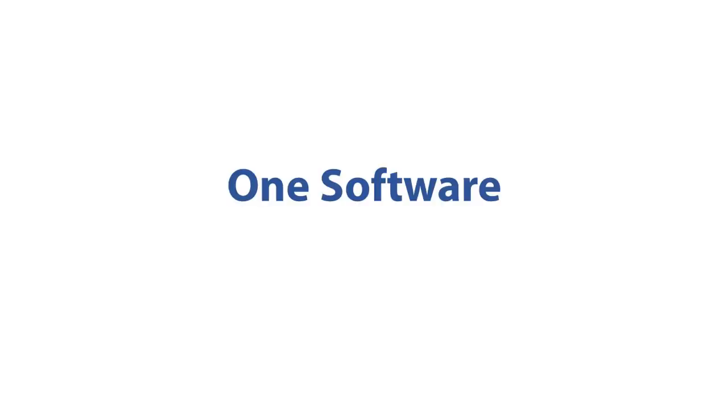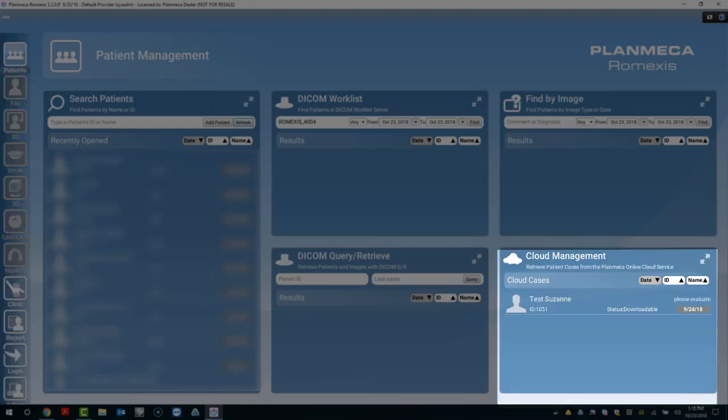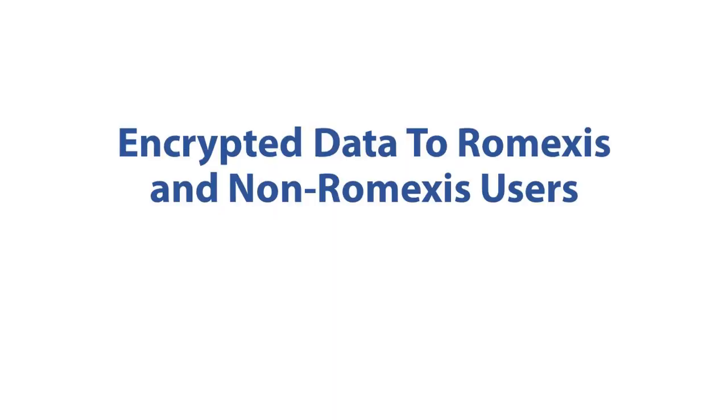Planmeca's Romexis software runs several modules within one software: 2D, Smile Design, 3D, Model Analyzer, CAD-CAM, and CLINIC. The cloud management is here. Encrypted data to Romexis and non-Romexis users.